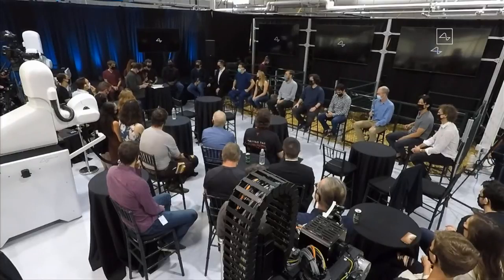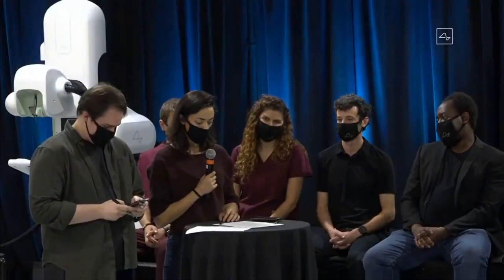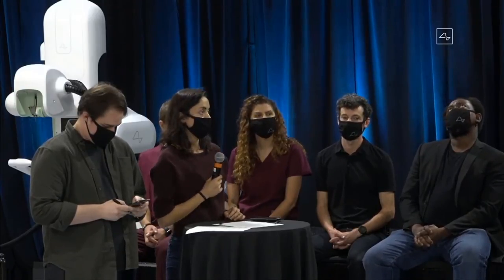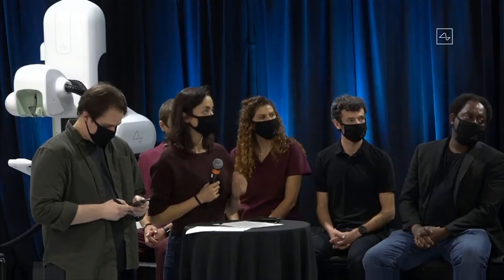All right, next question is, what is the most challenging problem that must be solved in order to meet Neuralink's ultimate goal? Well, I think one of the hardest problems is material science, and especially the insulation of the electrodes. What would you say? Yeah, absolutely.